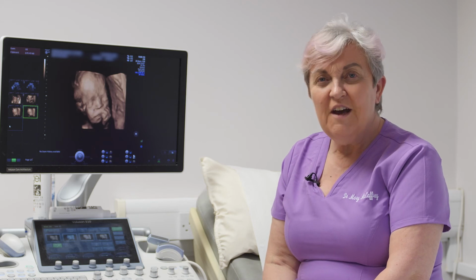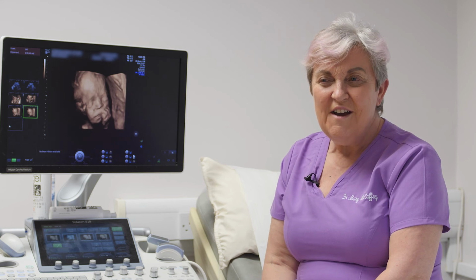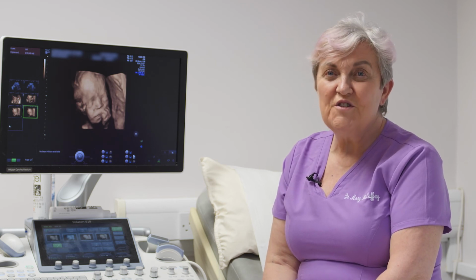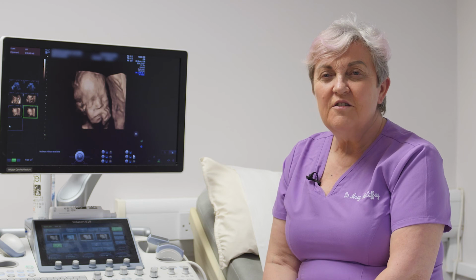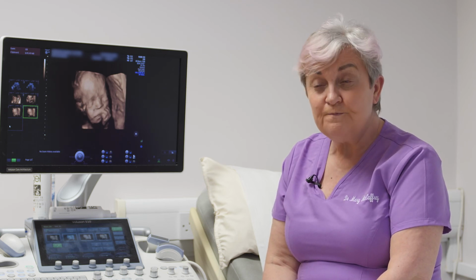And I suppose a lot of people talk to us about the gender. They want to know the gender of the baby from the scan. Realistically, we say 17 weeks at least. Sometimes with 3D you'll see that a little bit earlier, but by and large we would say 17 weeks is the earliest you'll see, and that you'll hear that result hopefully at the 20-week scan. But not all babies actually oblige us, though usually most of the time we'll manage to find that out. So that's an overview of what ultrasound scanning in pregnancy is about.